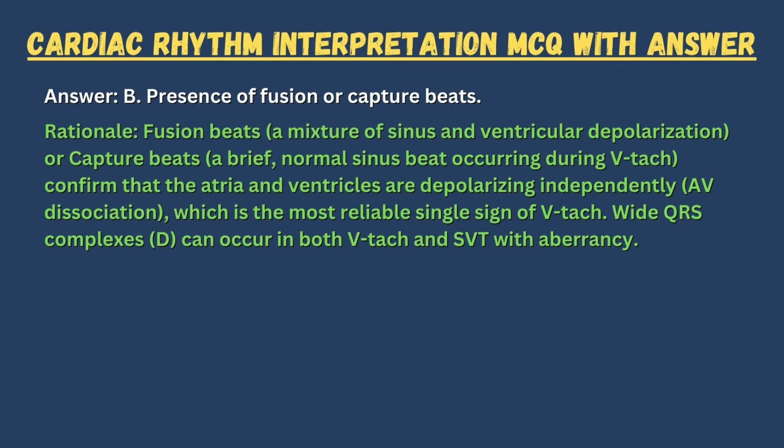Rationale. Fusion beats, a mixture of sinus and ventricular depolarization, or capture beats, a brief, normal sinus beat occurring during V-Tach, confirm that the atria and ventricles are depolarizing independently. AV dissociation, which is the most reliable single sign of V-Tach. Wide QRS complexes D can occur in both V-Tach and SVT with aberrancy.